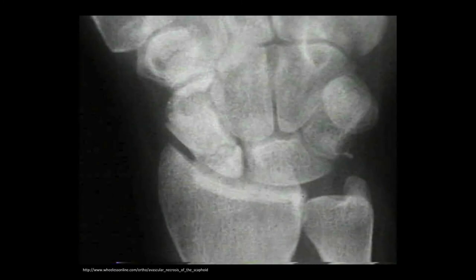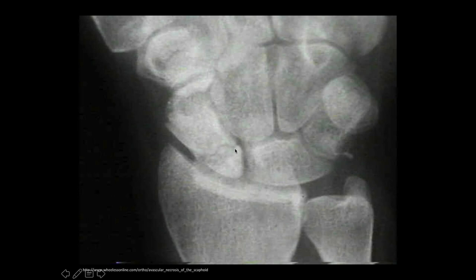Here's an example of avascular necrosis of a scaphoid fracture. The scaphoid bone is the most commonly fractured carpal bone. In this case, you can see a proximal pole fracture — because of the circumflex nature of the arteries feeding the bone, this is a bad site for fracture versus a waist or distal pole fracture. This bone is dying and becoming sclerotic — that's what happens in avascular necrosis. We still have normal alignment. You can see the joint spaces are about two to three millimeters each in the intercarpal spaces, which is normal.